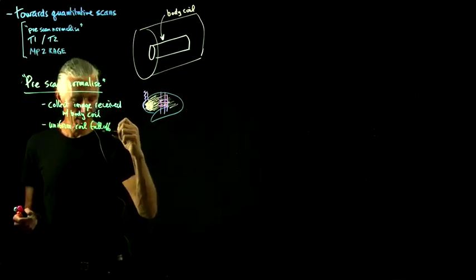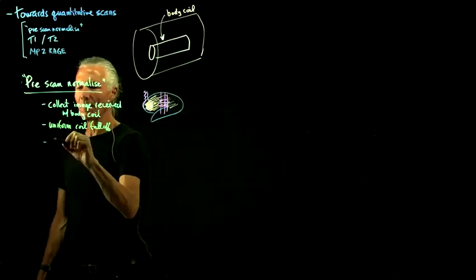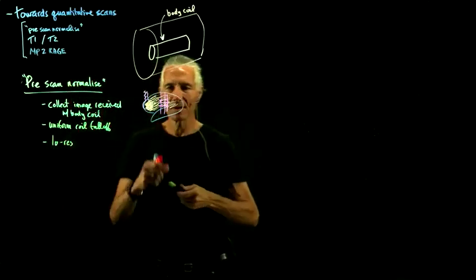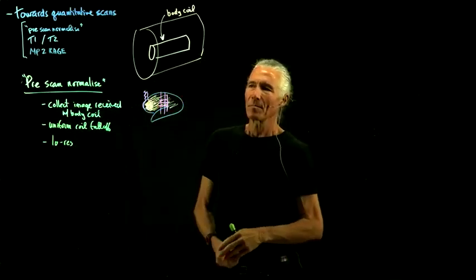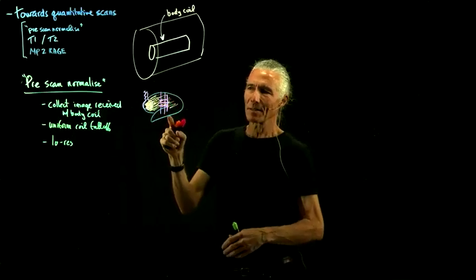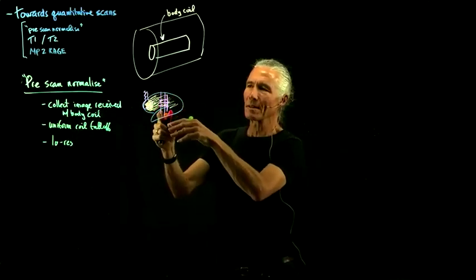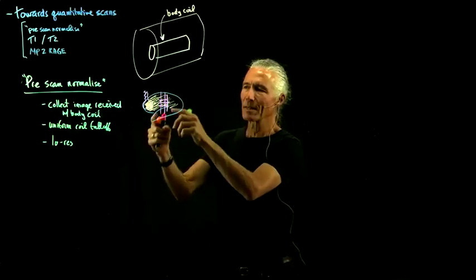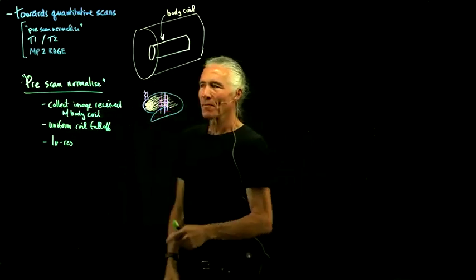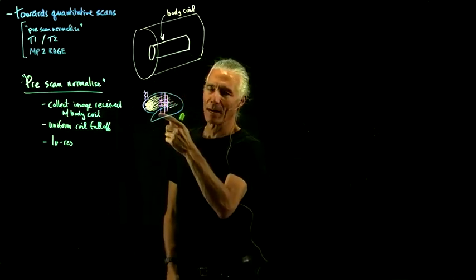And then you just go ahead and collect your regular scan. So it doesn't have to be very high res. And then now we've got the same object but recorded with these brightness varying scans. And so you can see there's various kinds of hacks you could do, like smooth the actual image that you get out to about the same smoothness as this one, and then try to divide by this image, especially if it doesn't have very much gray-white contrast.